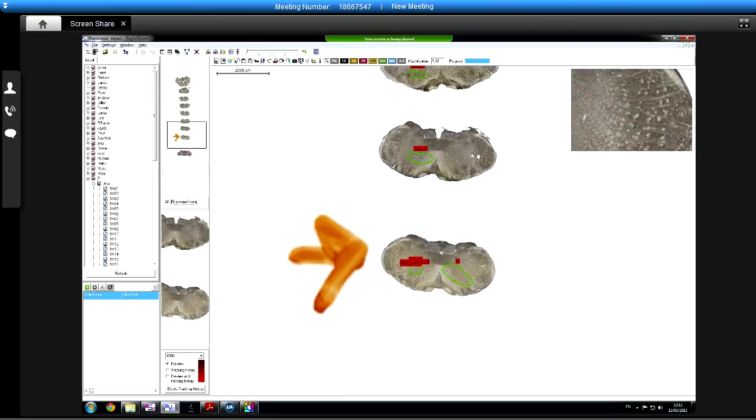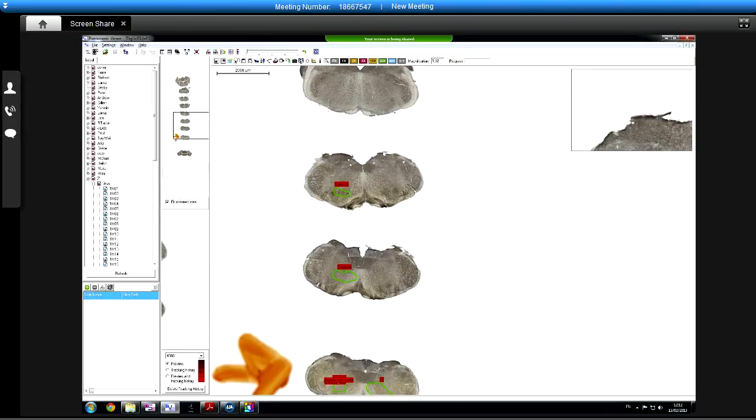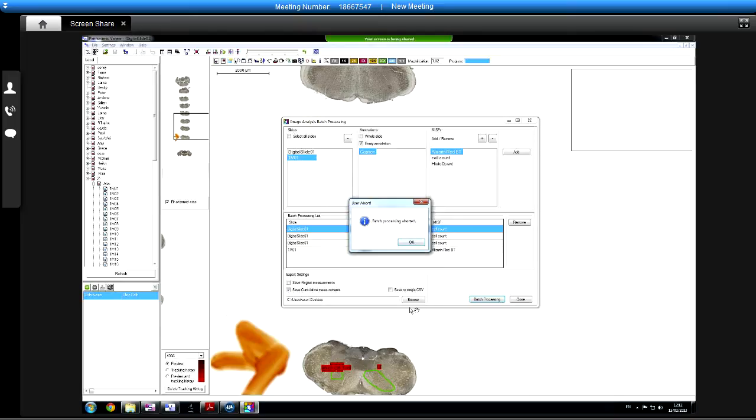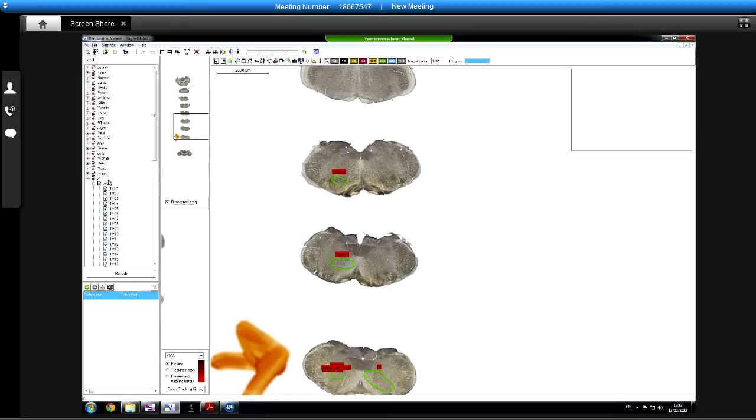I'll stop that. So how do you get those? Just go through, I'll go back through that. When you've got them all, I know how to get them all in that box on the bottom, on the left. How do you get into that? So we'll put some slides in again. It's this one here. It looks a little bit like this one. It's multicoloured. You put your mouse over here. It says image analysis modules.